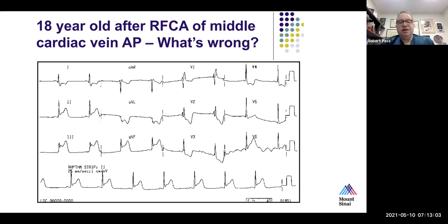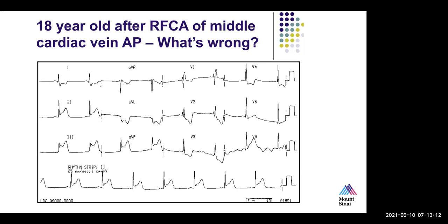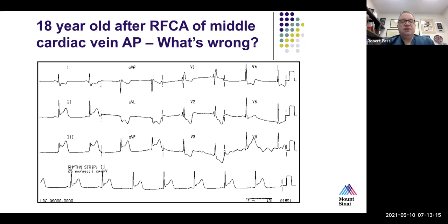An obvious answer, so I'll just share it. The reason is that a standard EP catheter is what we refer to as temperature control. That means you tell the device, I would like the tip of this catheter to reach a maximal temperature of whatever number you pick. Usually it's somewhere between 60 and 70 degrees Celsius. And then the system increases the power delivery to achieve the temperature that you've chosen, hence the term temperature control.